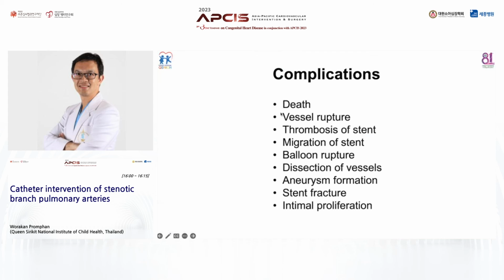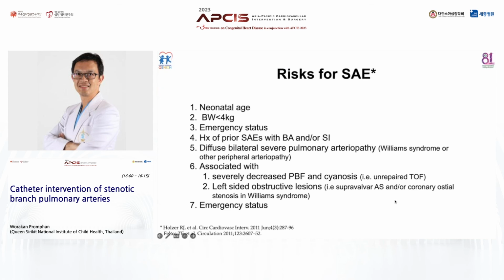Complications, of course, can range from very detrimental ones up to stent migration and balloon rupture. So those are things you need to be aware of on the table. The best thing is you should not have this happen. So be prepared for that.